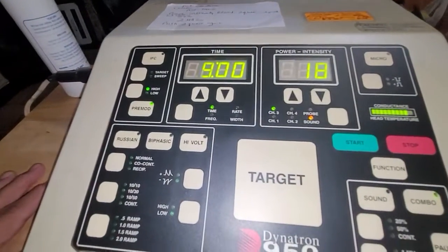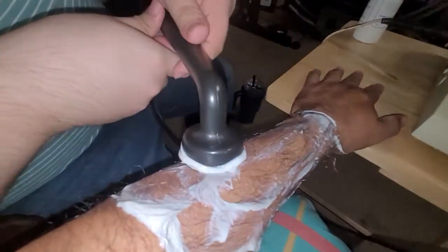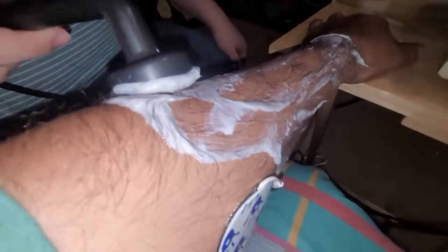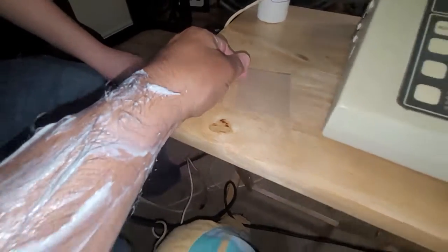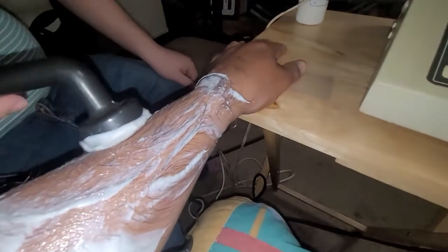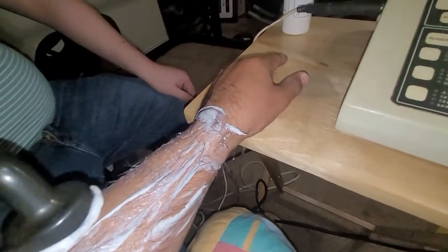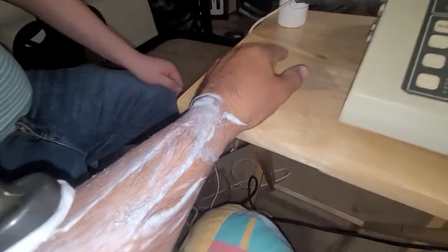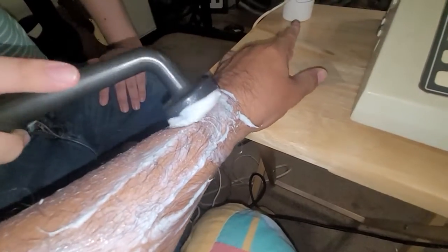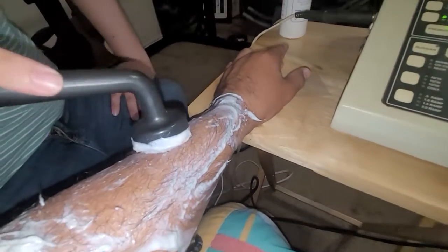The timer will go off and it'll shut down when it's all said and done. Just clean off the ultrasound head. It will be placed back in here. This electrode will be placed back onto the plastic sheeting. Try to remember which side the electrode came off of, because that way it doesn't lose its adhesiveness by getting dirt or oils on the electrode by putting it on the other side. And then with the unit, that's pretty much basically what it is.